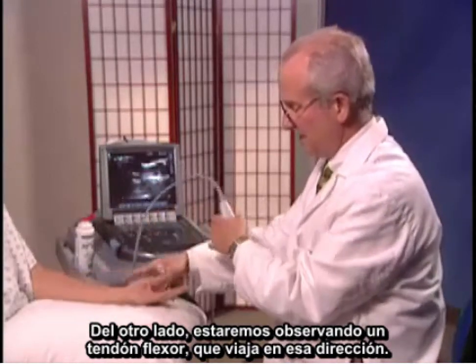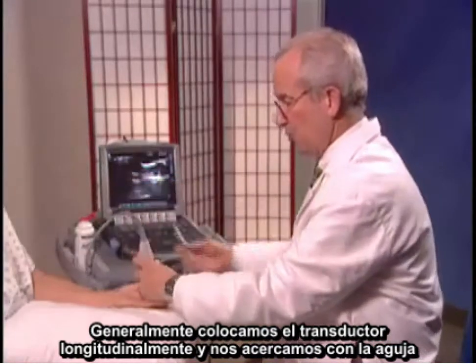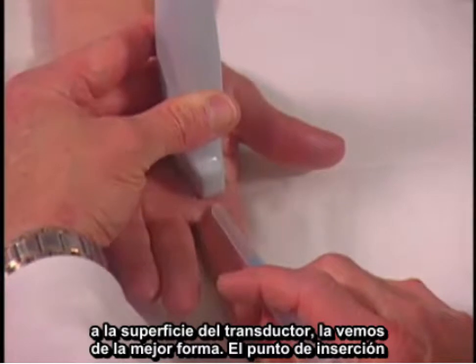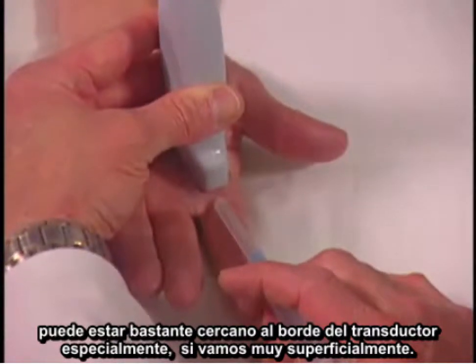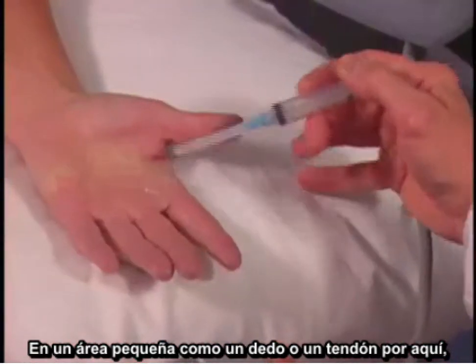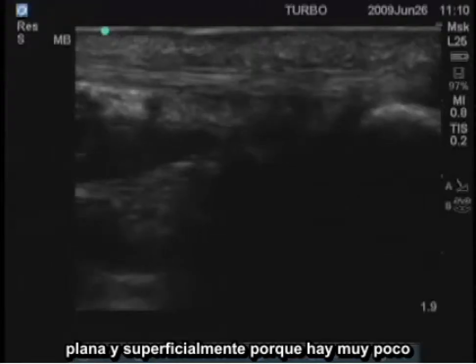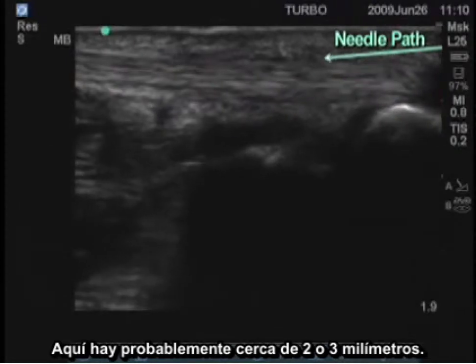On the other side, we'll be looking at a flexor tendon, which travels in this direction. I will usually place the transducer longitudinally and approach with the needle in this direction. If you keep the needle parallel to the surface of the transducer, it shows up the best. The insertion point can be quite close to the transducer's edge, especially if you're going very superficially. In a small area like a finger or a tendon, you don't have a lot of space, so you have to go very close and insert the needle very flat and superficially because there's very little space between the skin surface and the tendon.